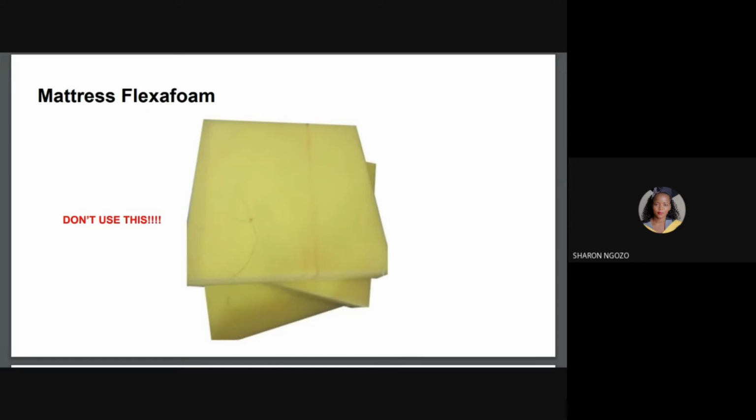Take the gauze and use plaster to tape it on the back panel to prevent it from falling off. Also make sure you don't use too much gauze. You don't want to fold it too many times, because that can minimize the flow of air into the machine. So just fold it a few times, 2 to 3 times, then tape it on the back panel.